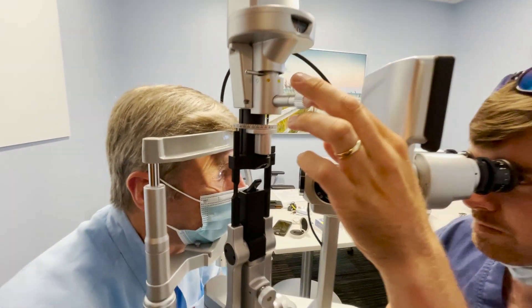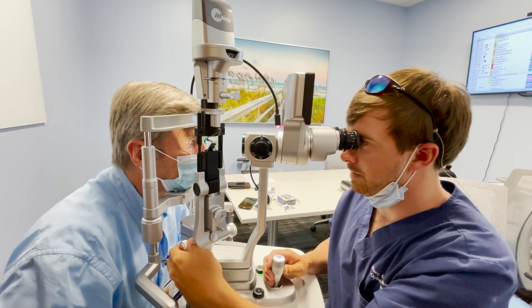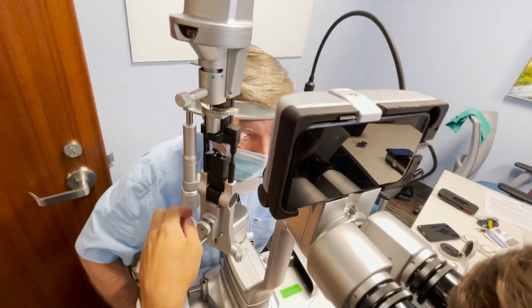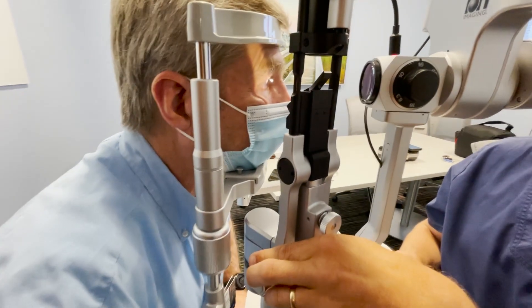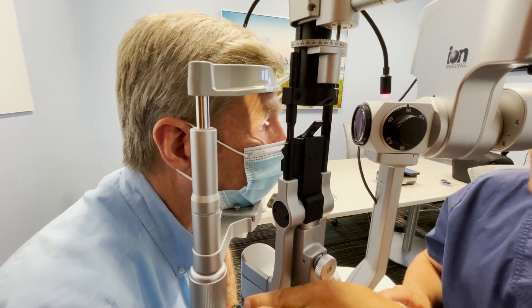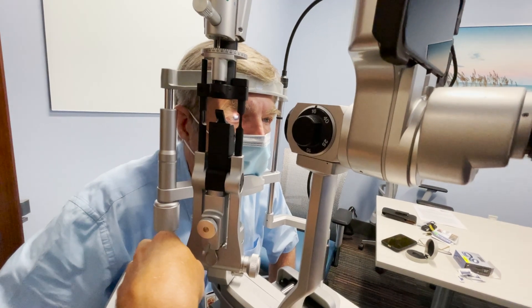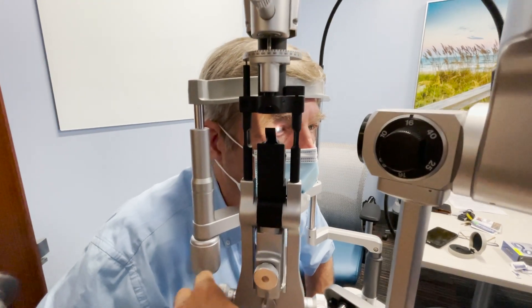A short beam is also important for looking for inflammation in the eye. You want the beam short and relatively fat, magnified to 16x. You can then focus in and out to look for microscopic cells in the anterior chamber — to look for uveitis, hyphema, or inflammation. You see cell and flare best with a very small, very short, fat beam. Then look in between the two lights and focus back and forth with this knob.